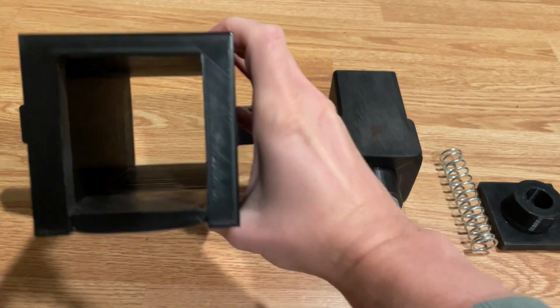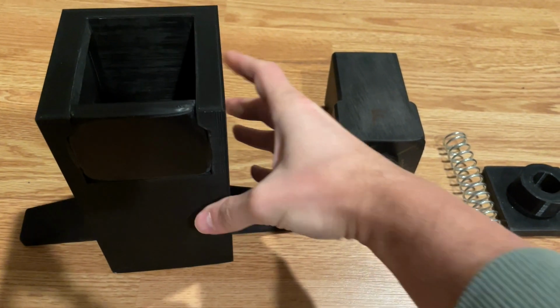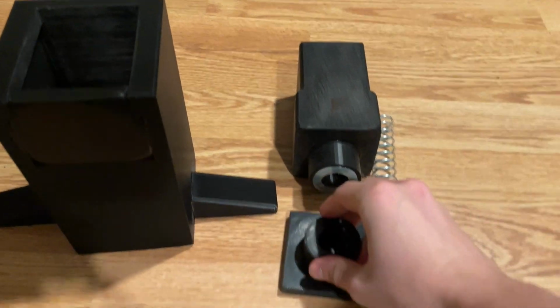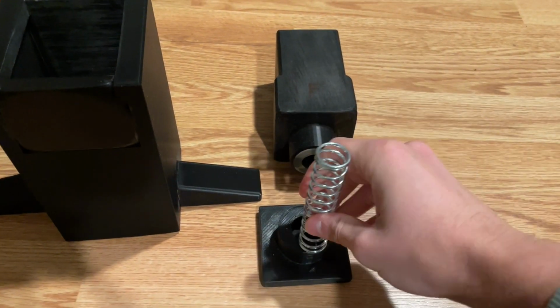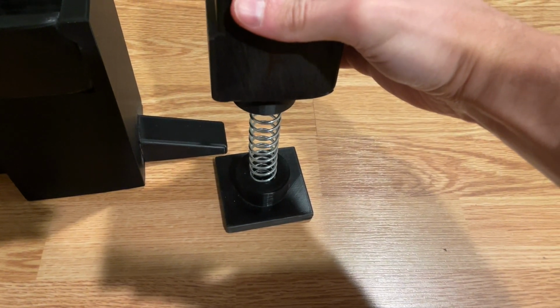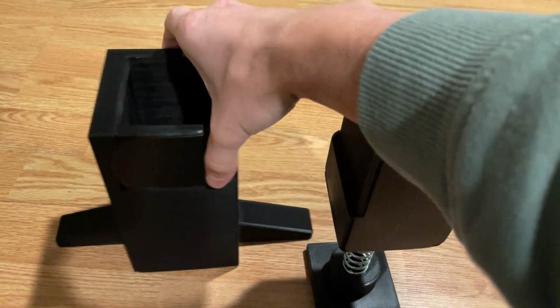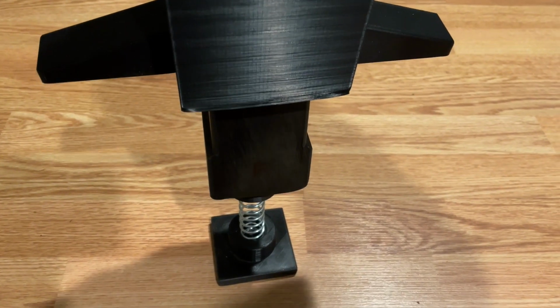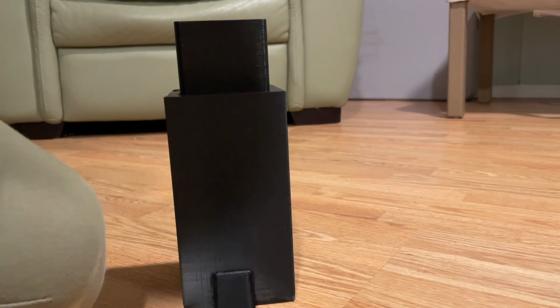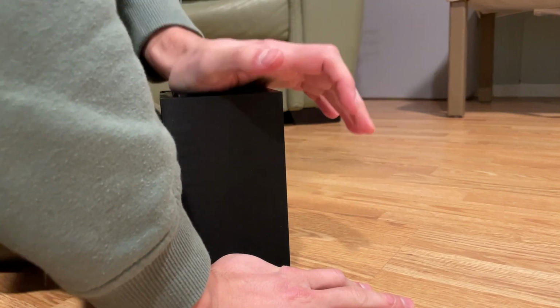The following video will explain the proof of concept CPR device to show it in action and provide a demonstration of how it works. The device consists of a simple compression spring mechanism that allows the user to press down and offer resistance. The spring then returns the device back to its original position once pressure is no longer applied.